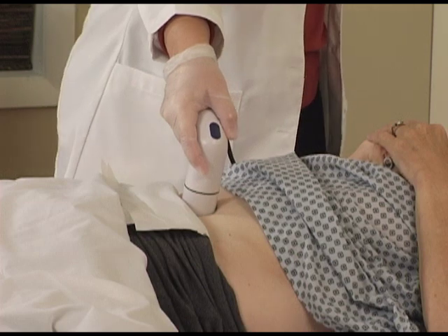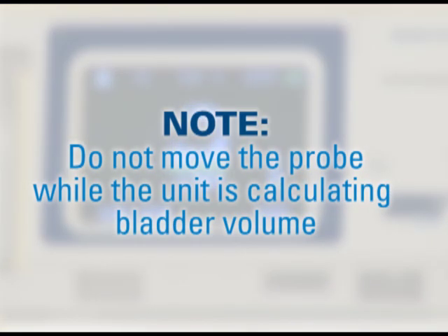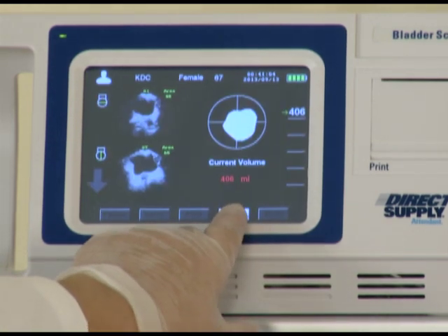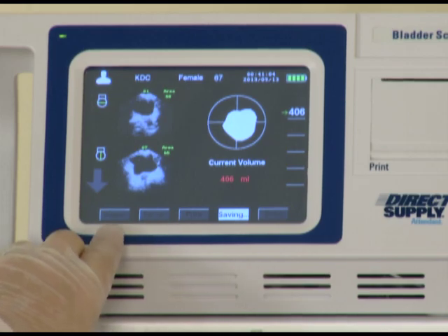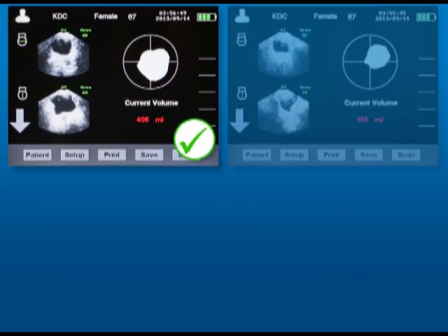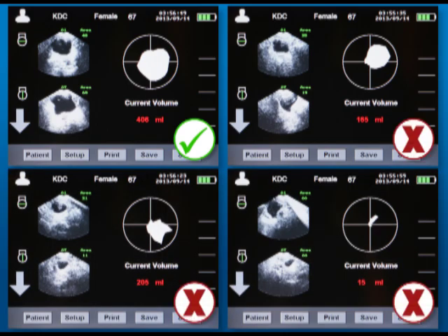Hold the probe steady and release the blue button to conduct the scan. The probe will vibrate slightly and the screen will indicate 'calculating' to let you know the scan is being completed. Do not move the probe until the calculating step is complete. After the scan is complete, the crosshair symbol on the screen will show an image of the volume and the volume amount in milliliters. You'll know you obtained a good scan if the image is as large and centered as possible in the middle of the crosshairs. If the image is not fully centered or appears small or spike-like, the scan should be completed again.